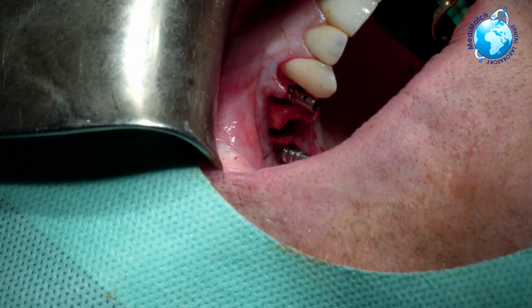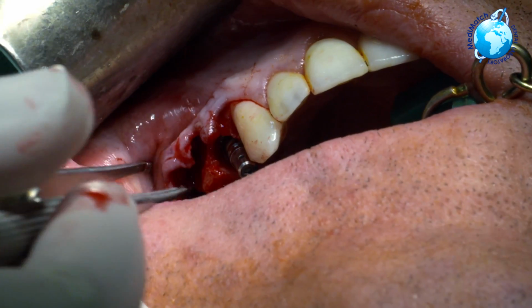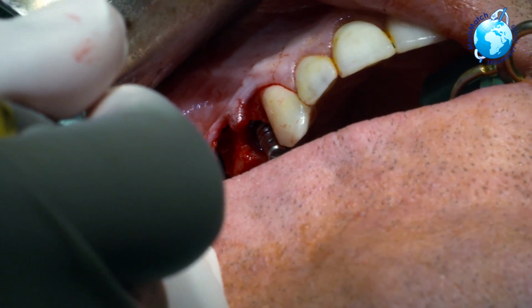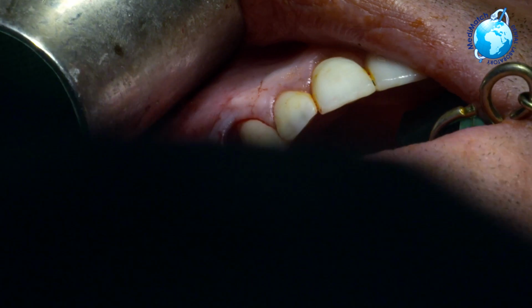Open for me, Alan. And we're going to get me some Ethos, please. So we're going to use a little bit of synthetic grafting. Just check our directions. And we're just going to build a little bit of bone in that region to build these areas up and support the implants in this area. So the girls are just mixing some synthetic bone material, and I'm quite happy with that. Open wide, Alan.